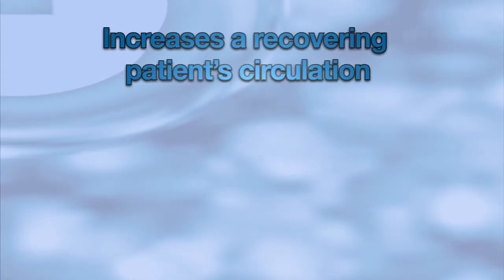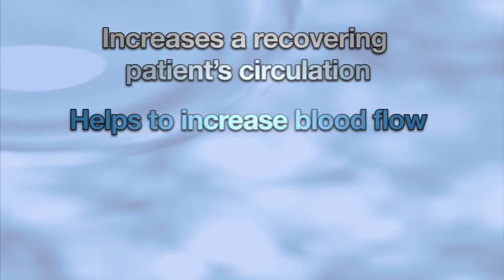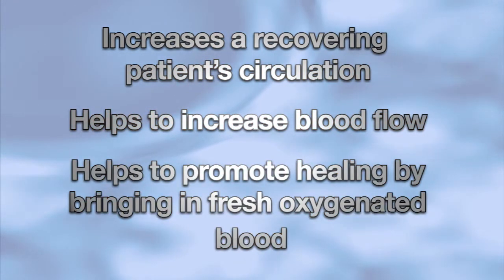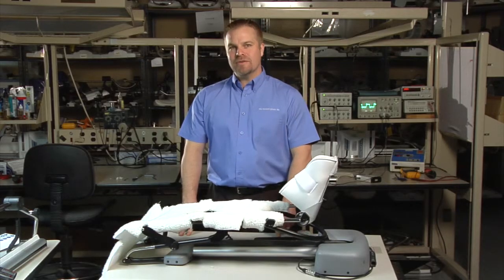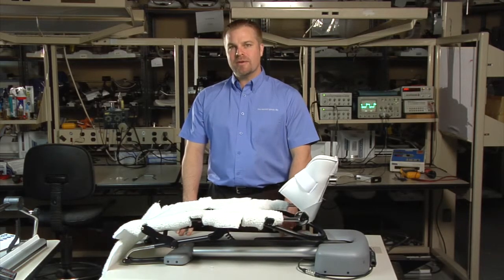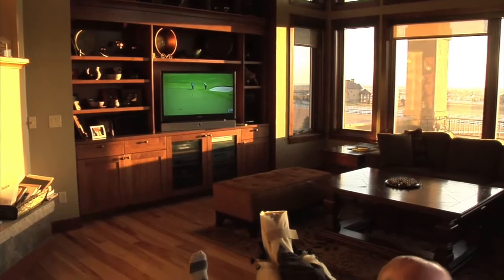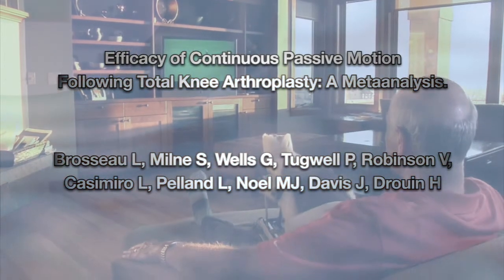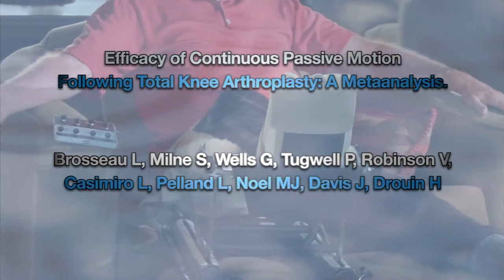CPM therapy also increases a recovering patient's circulation. This helps increase the blood flow, which helps to improve healing by bringing in fresh blood filled with oxygen and other nutrients. As the swelling and pain are reduced and fresh blood is brought to the repaired joint, the patient's ability to bend the knee increases. As a matter of fact, studies have shown that a patient can leave the hospital sooner when CPM therapy is used due to their increased range of motion.